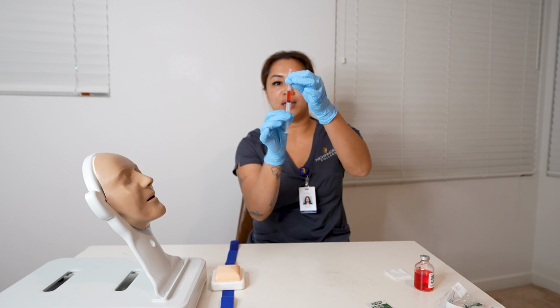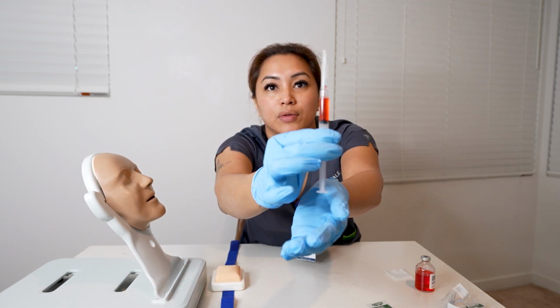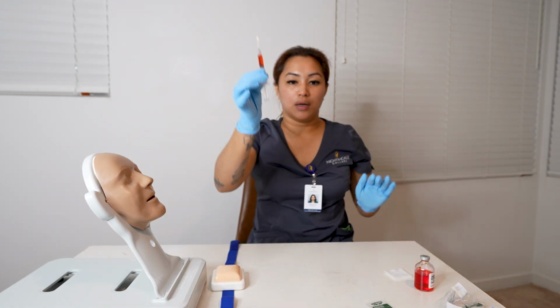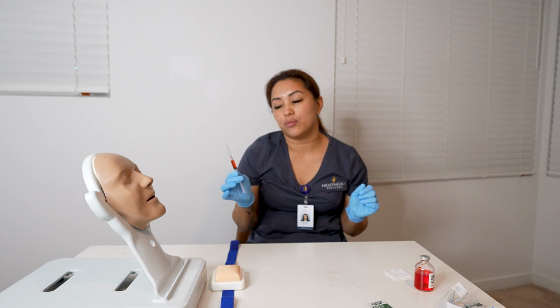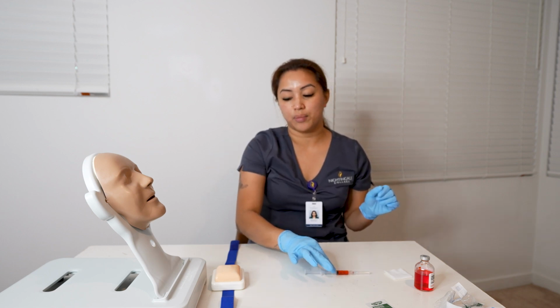Now I'm going to cap it, and this is 1.5. You guys can see that 1.5. Alrighty, 1.5. So now that we drew the medication, prepared it.